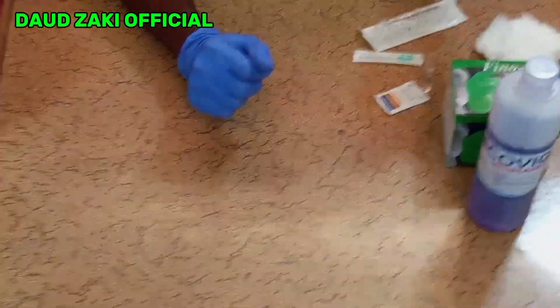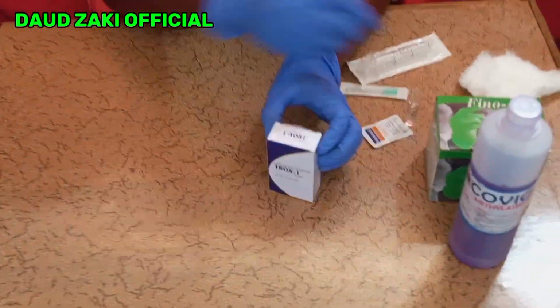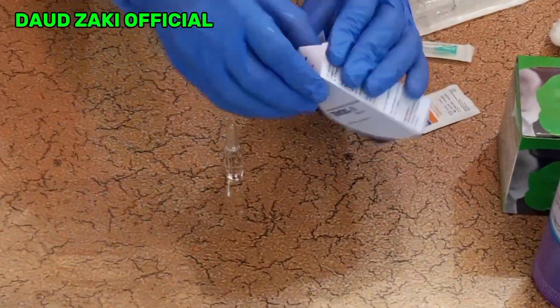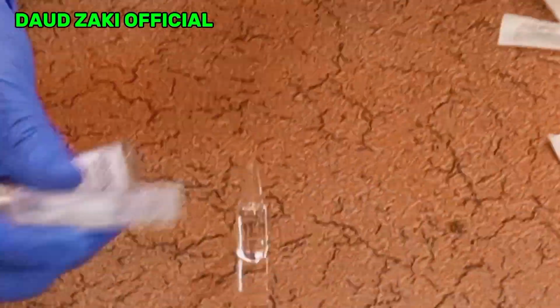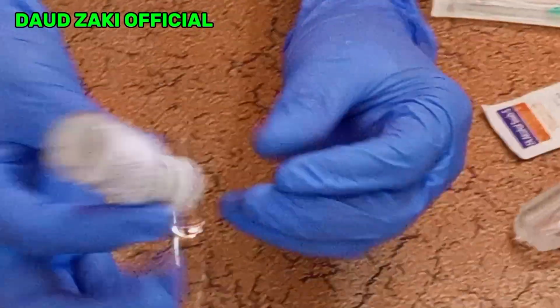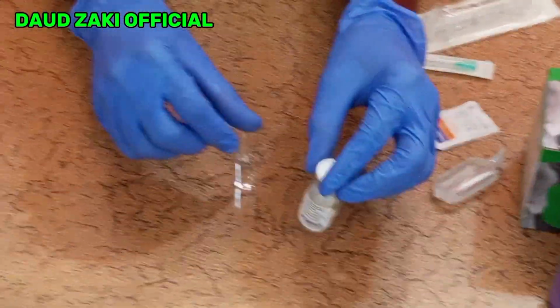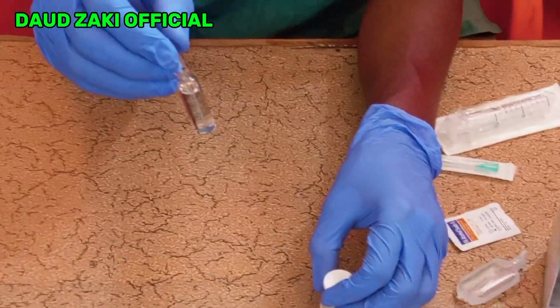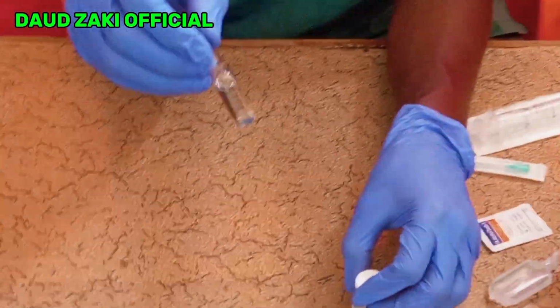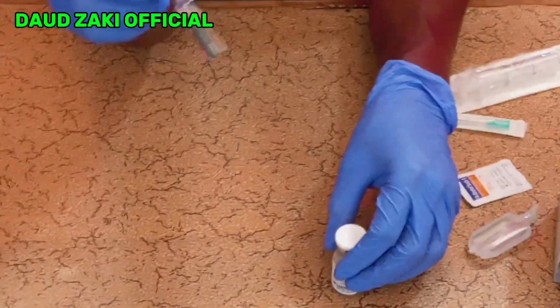Okay, generally we always have a medication contained in either a vial or an ampoule. So let me show you now. This is a vial containing white powder of a drug, and this is an ampoule. The medication is already in solution form, so you don't need to dilute or reconstitute. You only need to withdraw the drug from the ampoule. So this is an ampoule and this is a vial.